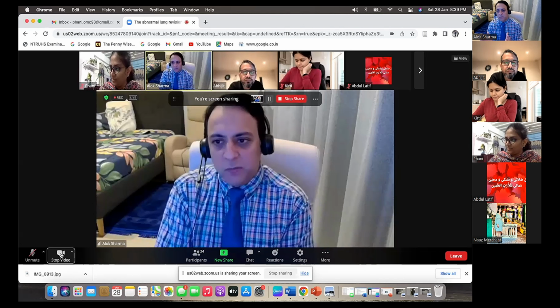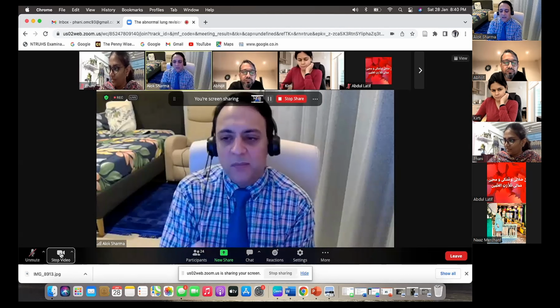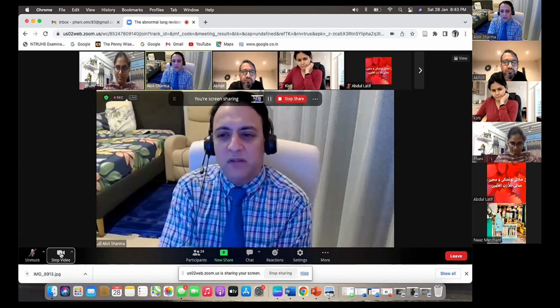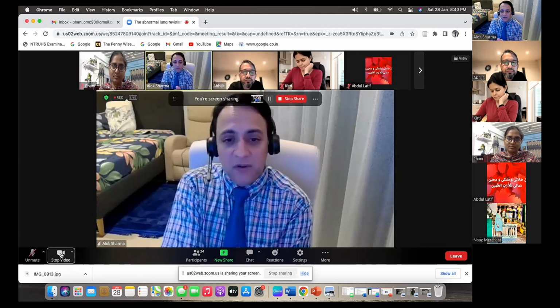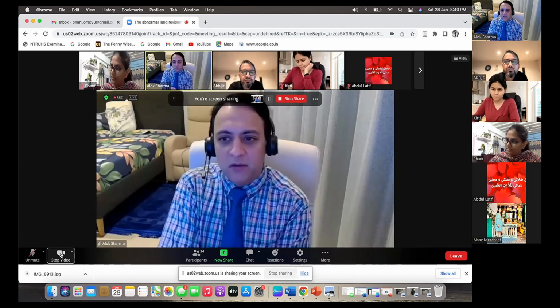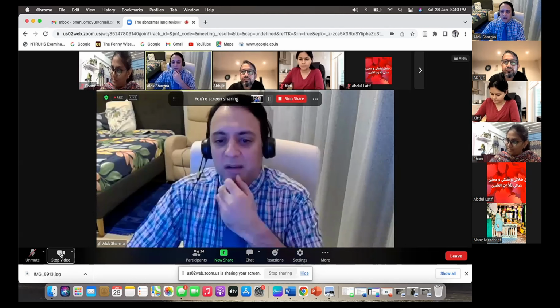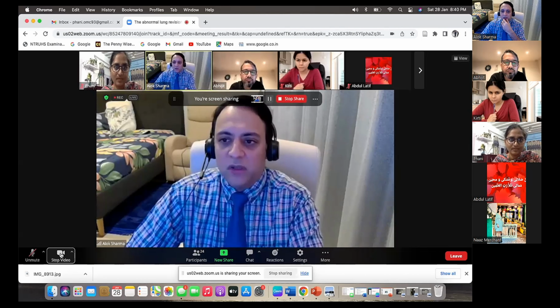The back is quite big, and as you slant, sometimes you're more lateral at the back. So try to keep yourself as close or just lateral to the spine and image those areas. It might mean you have to move the image laterally to get your best image. You might end up getting quite a few images for R5, R6, just to make sure you've got your image acquisition really nice.